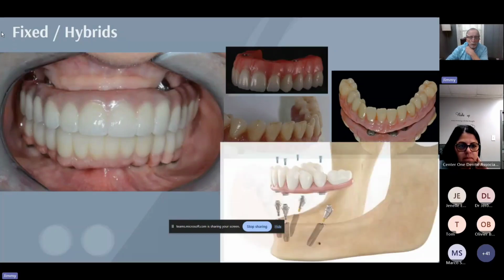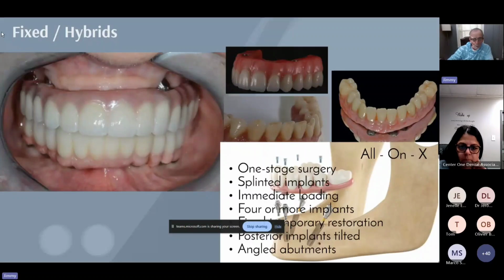The implants are designed and placed, and if the posterior implants are angled, then we have to do some angle correction with some abutments and maybe put some MUAs, multi-unit abutments, on top of it, and then create the restoration and that screwed to the multi-unit abutments. There are some workflows where we can screw directly to the implants, but in most cases, we're going to put some type of abutment on top of the implants. And that's the typical all on X.